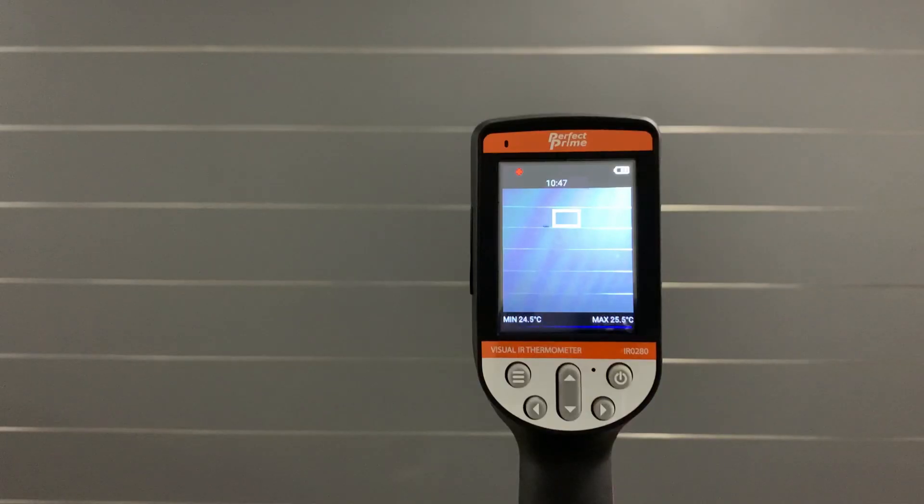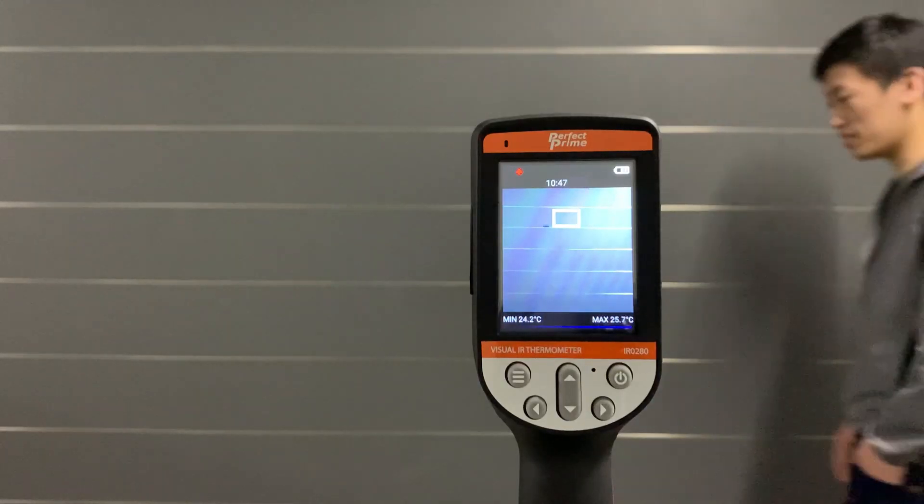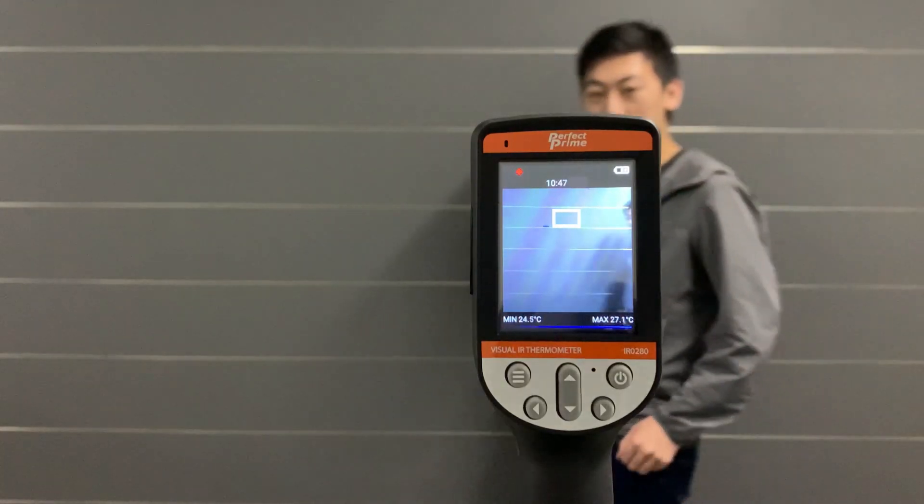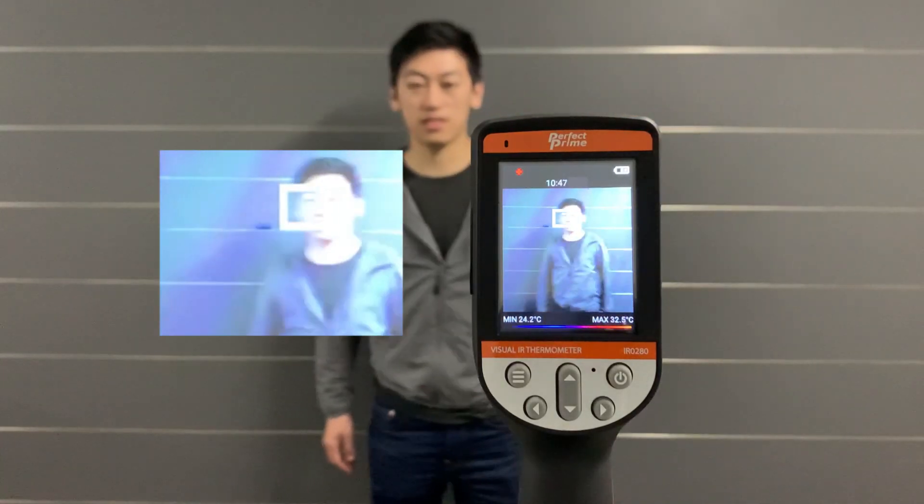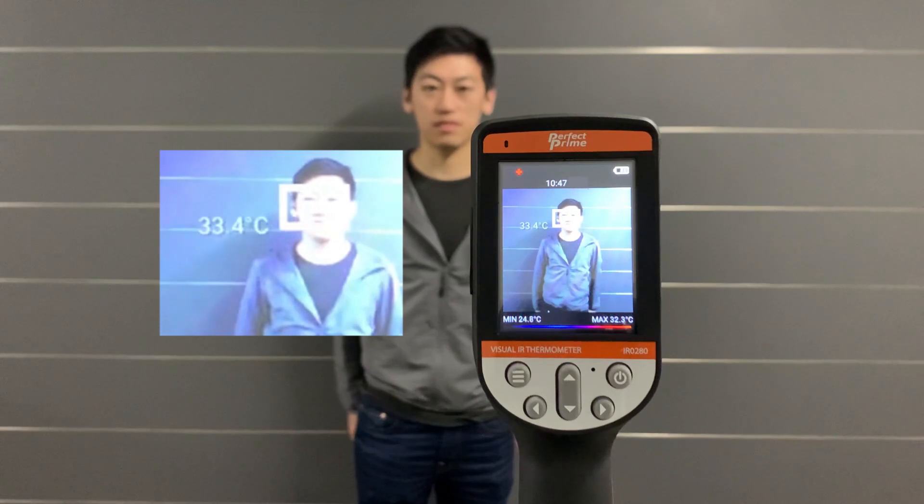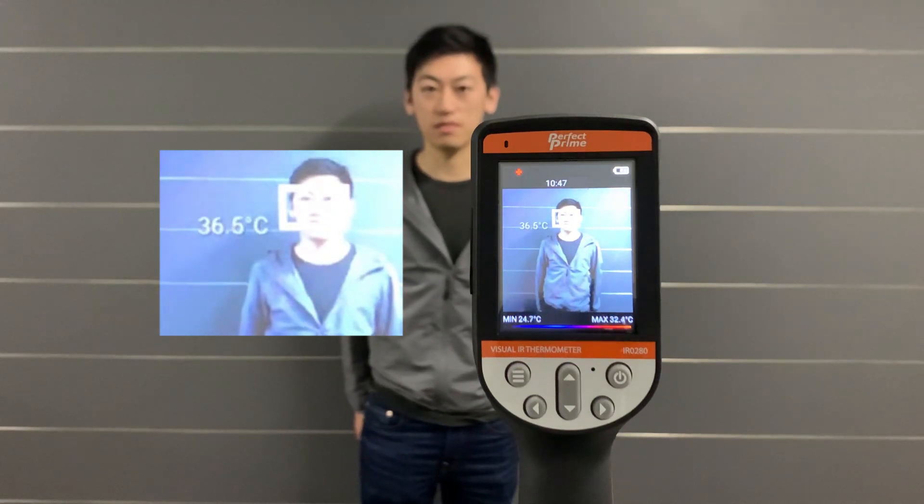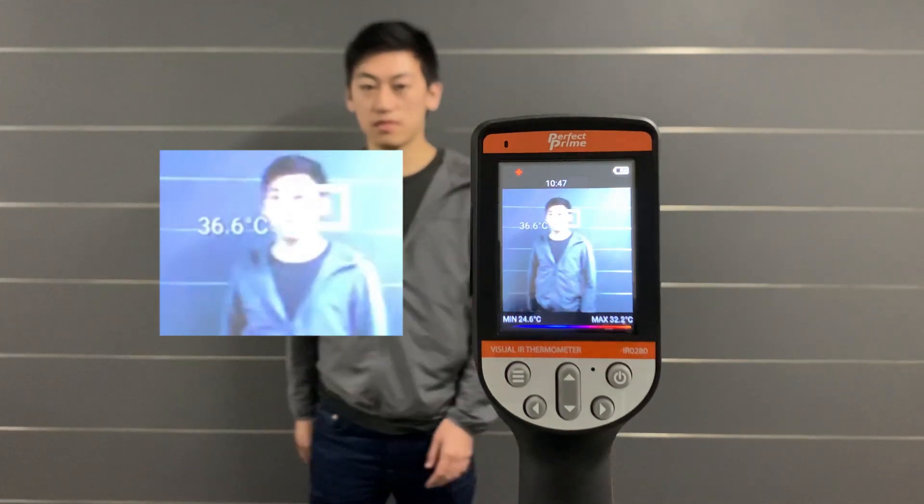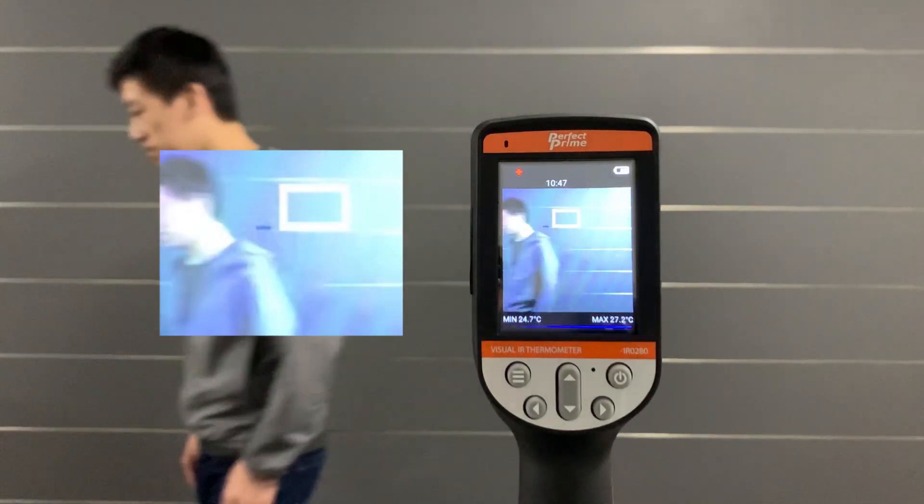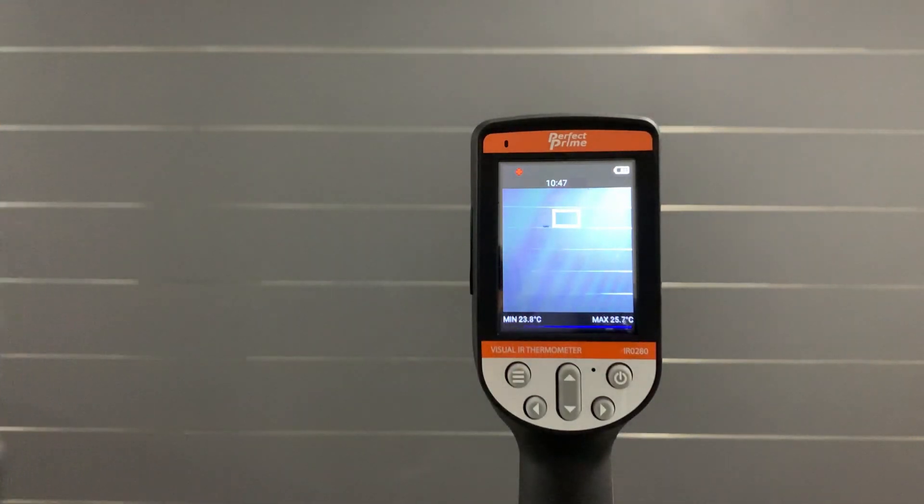It has two tracking modes. The white box detection mode is designed for forehead tracking, where the user points the thermal camera so that a person's forehead is within the box.